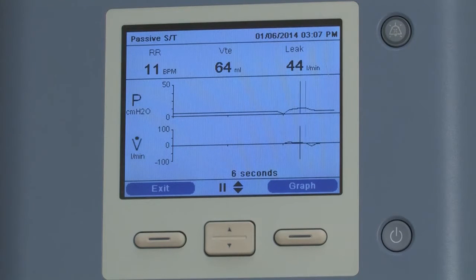In addition, there is a nebulizer on-off feature. When you turn the nebulizer feature on, it is disabling certain alarms that would normally audibly alarm because you've added flow to the circuit. So the Triology does not provide the nebulizer treatment, but it can accommodate alarms so that if you add a nebulizer treatment in line to the circuitry, for example, giving your child albuterol for about 5 minutes, the Triology will accommodate the extra flow that you've added into the circuitry.